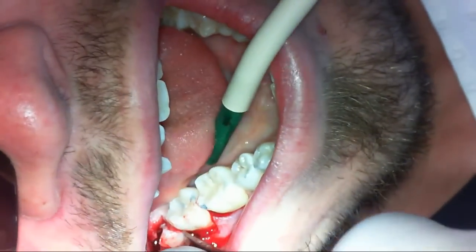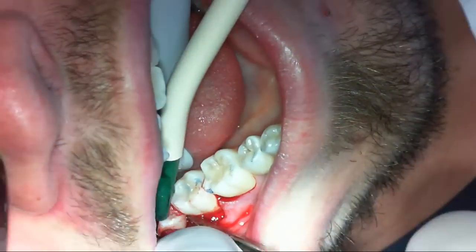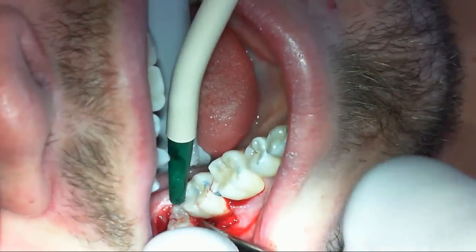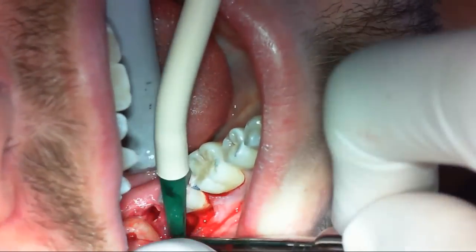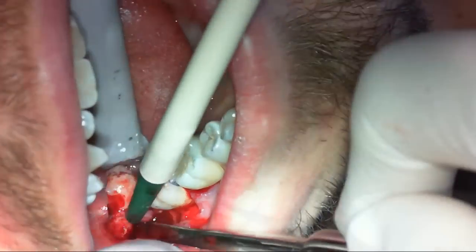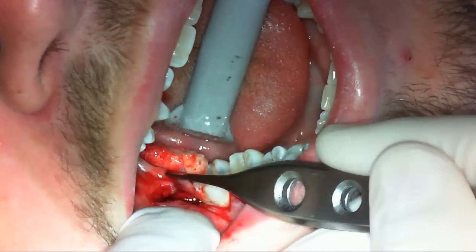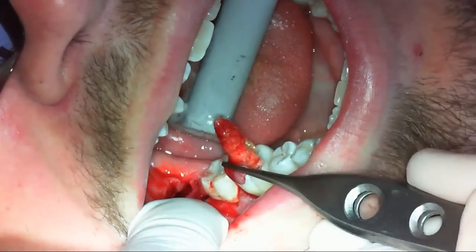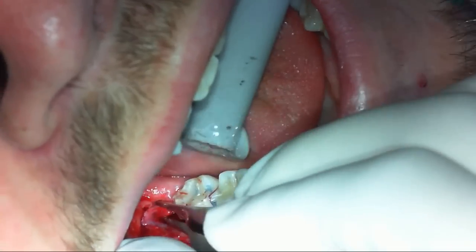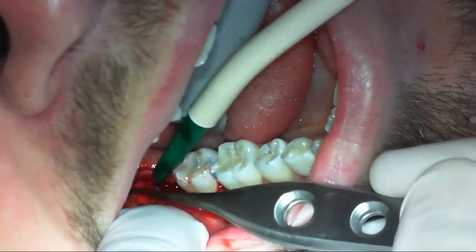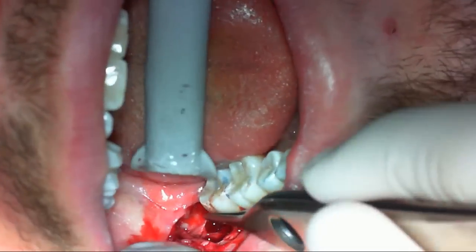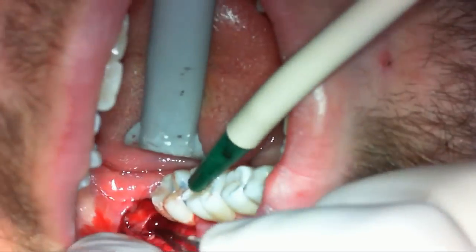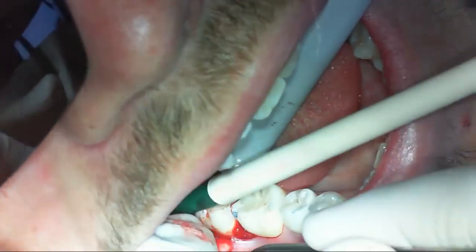The mesial part is now being delivered. With an adequate gutter, adequate distal bone removal, and a good section, the surgery can be very easy with minimum complications. Just cleaning some of the soft tissue around the crown — you can see the mesial root had two roots on it, and the distal was around one root.